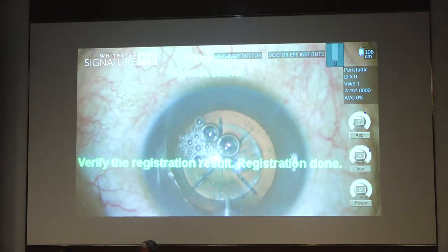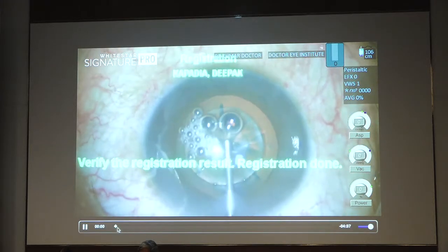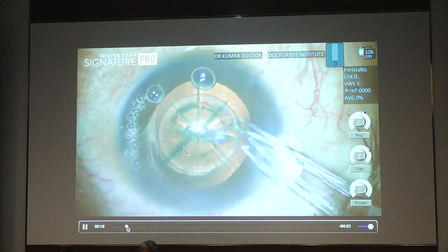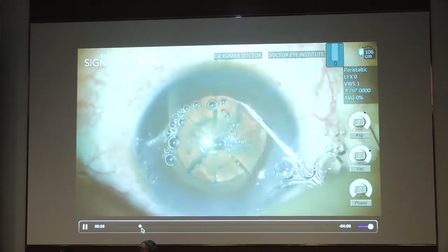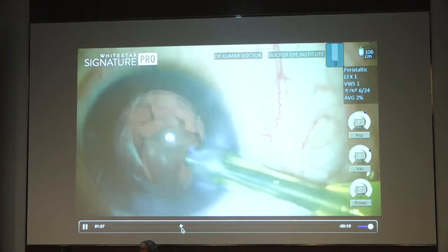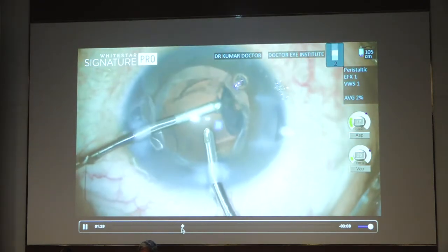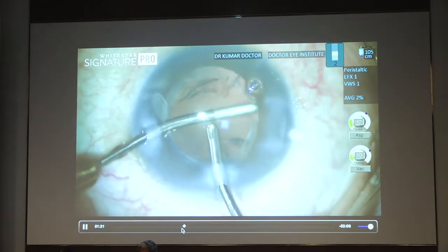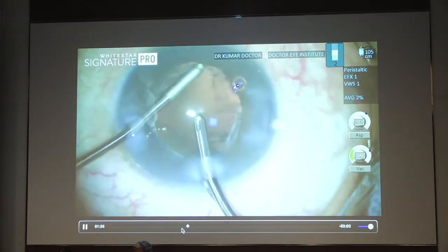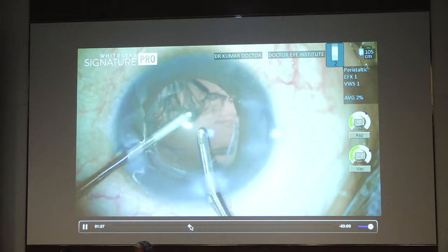I'm just showing a little bit of the surgery here. Very, very shallow anterior chamber. I had performed a Z8 femto, made the incisions with the laser itself, picked up the rhexis, and went ahead and did phacoemulsification. Very surprisingly in this case, in spite of clearing a 4.37 lens, I did not find so much space as far as the IOL was concerned.